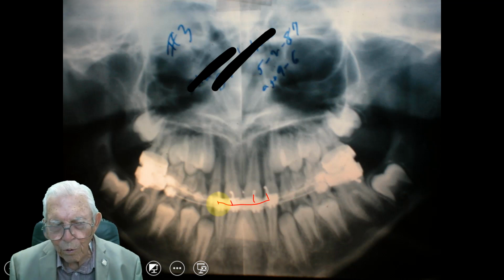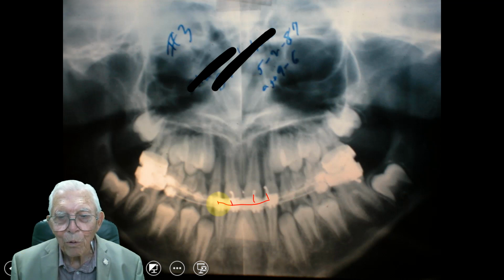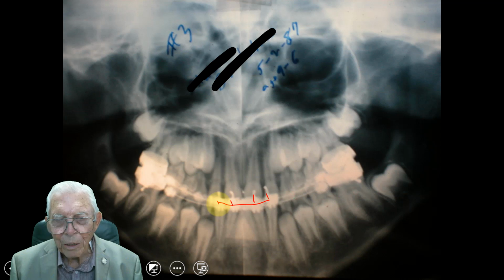We want to solder them, and then we weld them. In addition to solder, we spot weld the wire to the tooth. So we don't want to lose one of these. If you do, you swallow it. We've had a few people swallow some of those if you break them off, but we followed them, and they don't hang up on something inside.